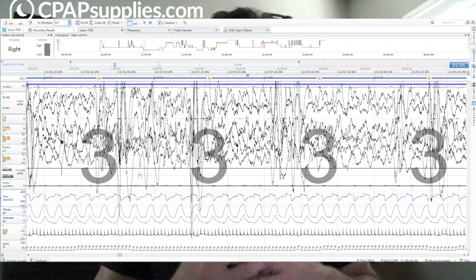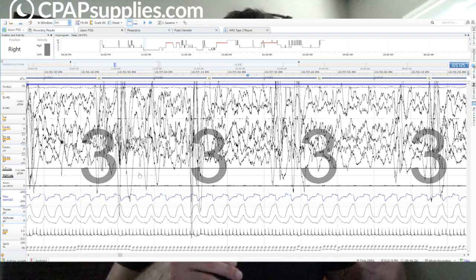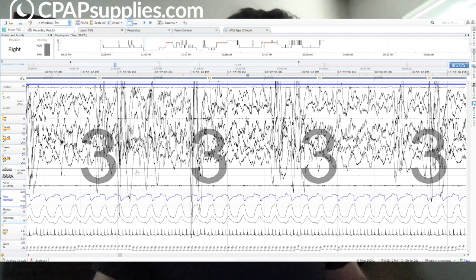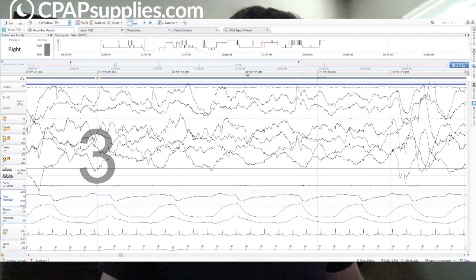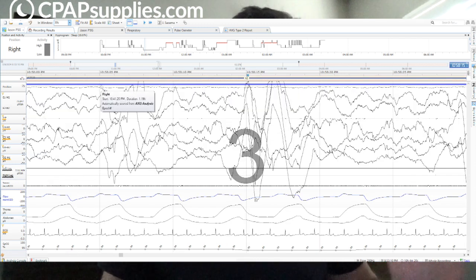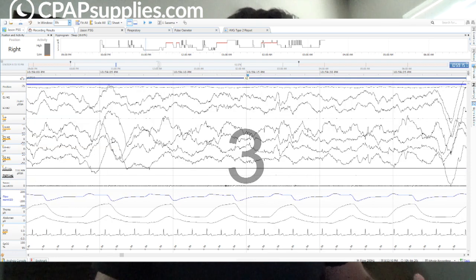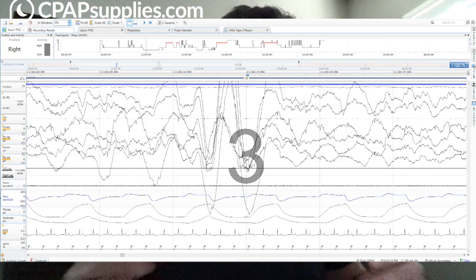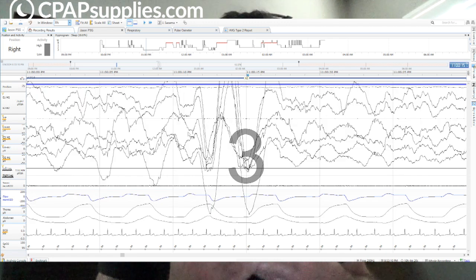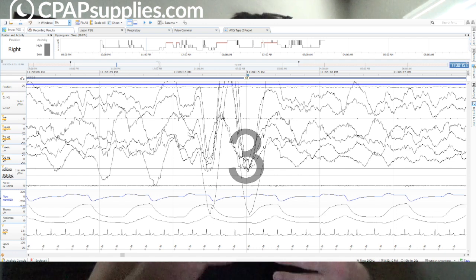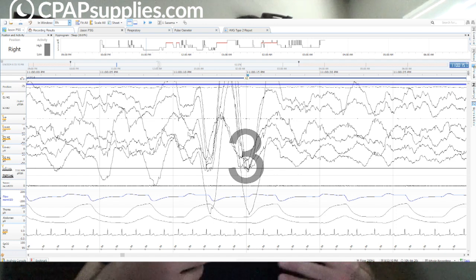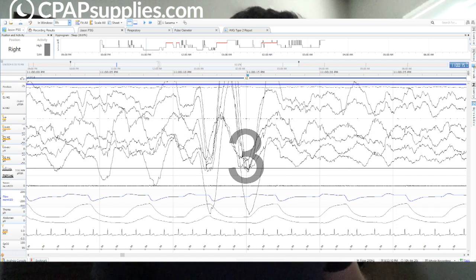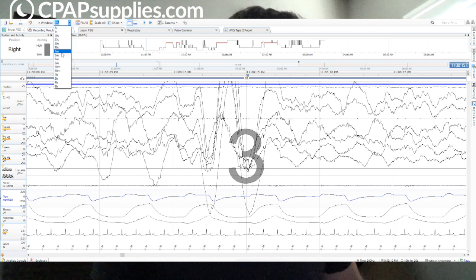This is something that people with fibromyalgia, they have alpha intrusion in it. It's like disruptive. But stage three sleep is thought to be, let me shift this to 30 seconds, you can see a little better. Look at these big slow wave sleeps. There's no alpha intrusion. This is just regular delta sleep. Nice and slow. So this is where musculoskeletal systems are repaired, hence the link to fibromyalgia, why they always feel so achy. They have messed up delta sleep.